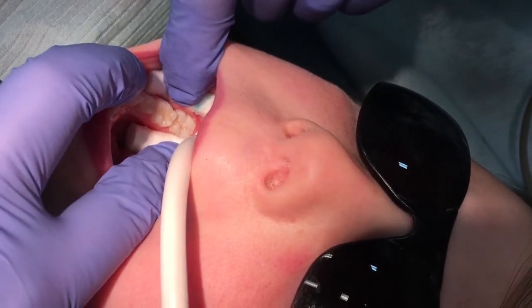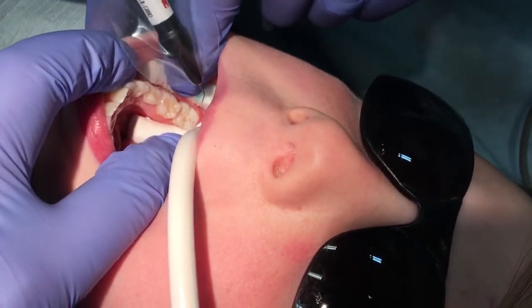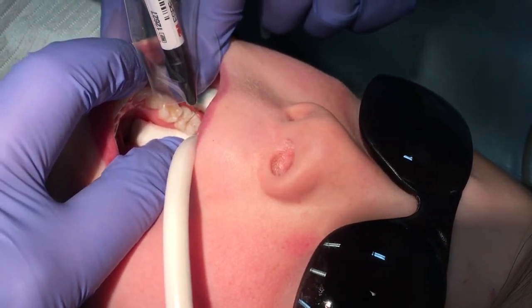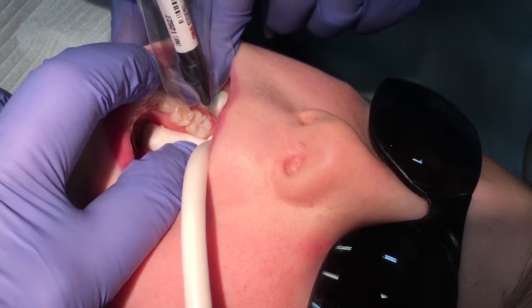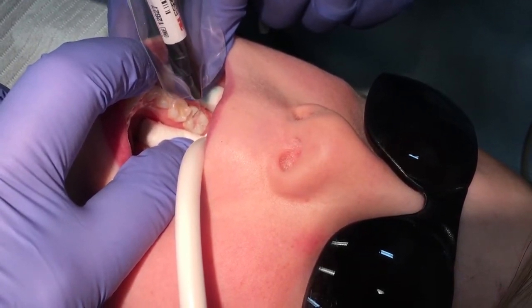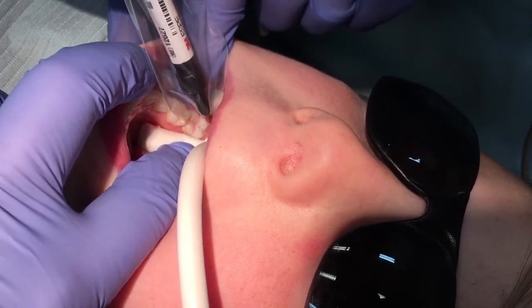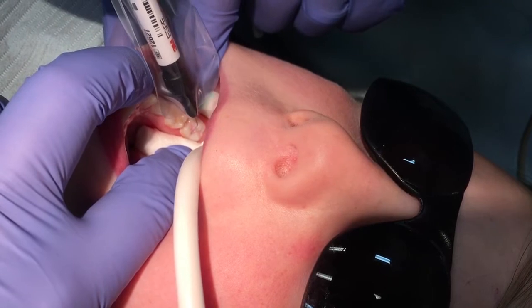Then place the sealant. Sealant material should be placed in all vulnerable grooves and pits — occlusals, buccals, and linguals. Occlusals are the most common surfaces to decay, but buccals and linguals are the second most common, even decaying more often than interproximal surfaces. Make the most of this opportunity to protect all accessible surfaces.